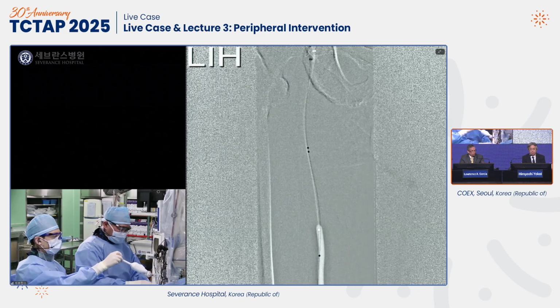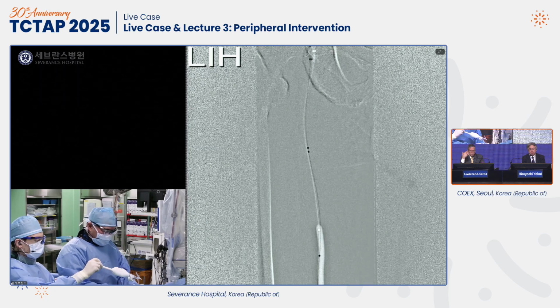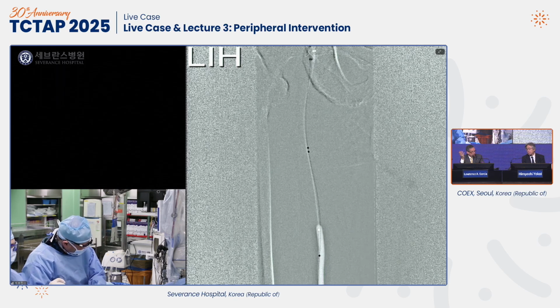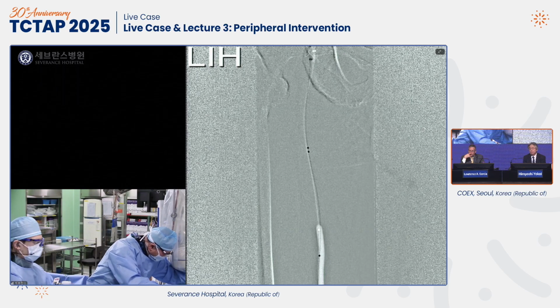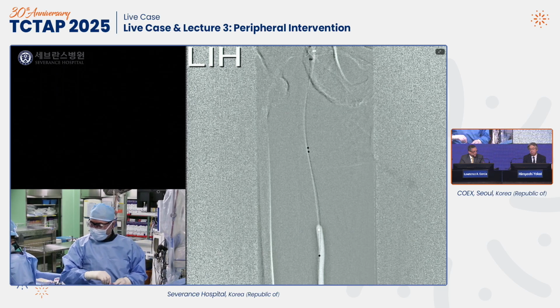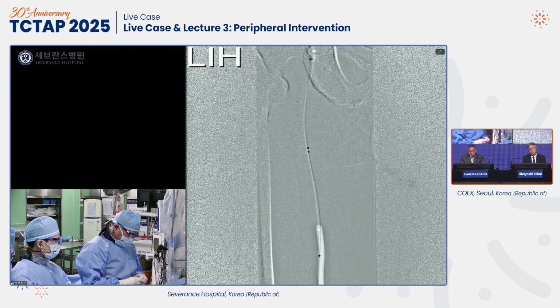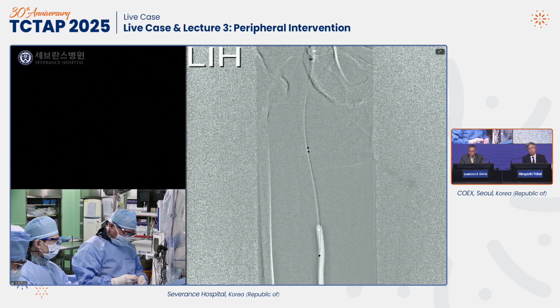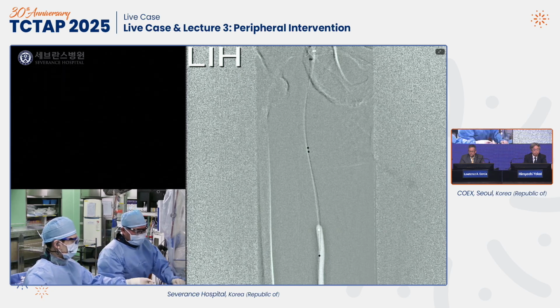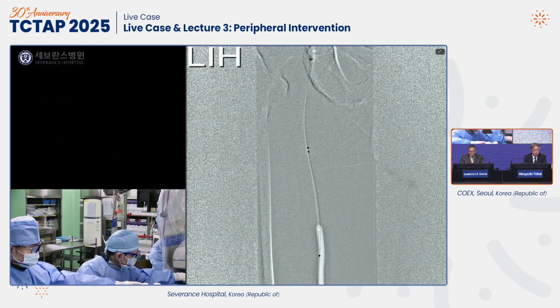I think Makari went to 4 minutes for drug dwell. At the end of the day, for those of us old enough to remember the old angioplasty days, what's old is new again. The longer you do angioplasty, the better. It just gives you a better luminal result. But whether or not it transfers more drug on a device which loses 90% of its drug just in transit is probably not germane to this. But the angioplasty, of course, is still the mechanical side of it. For coronary artery, just 1 minute is usually sufficient. So I think longer than 1 minute will be okay. That's my opinion.